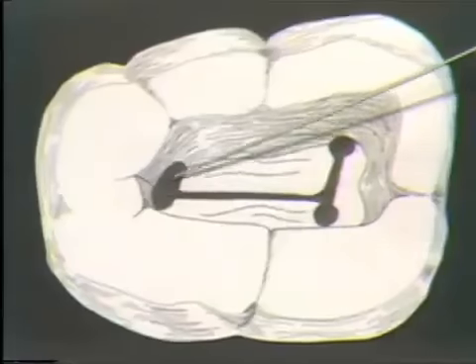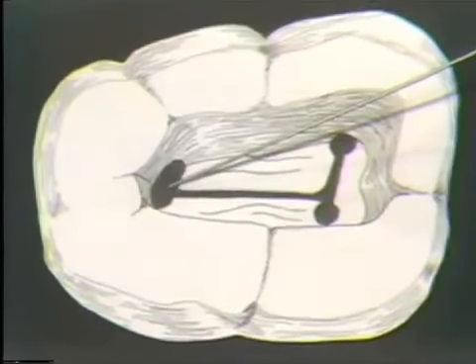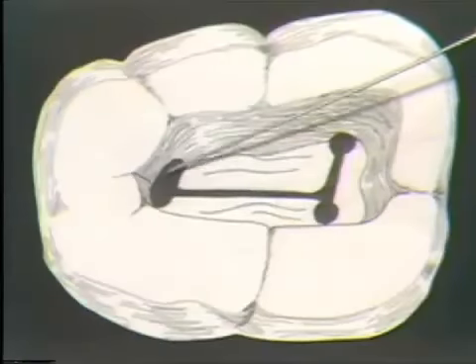The mesial lingual canal is not that far to the lingual. Most people look for it way out underneath the mesial lingual cusp, but it's actually almost in the center of the tooth. And then almost directly distal to the mesial lingual is the big distal canal. Now that canal sometimes has 2 canals instead of 1. So you have to check that canal, probing it in different directions to look for 2 small canals on the distal instead of one big canal.